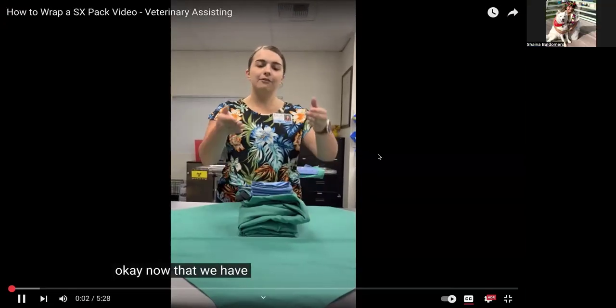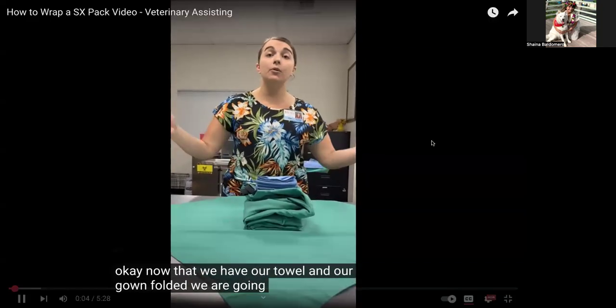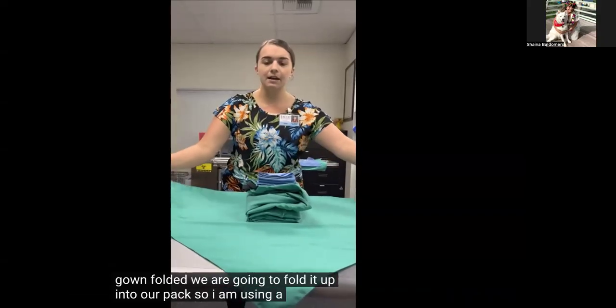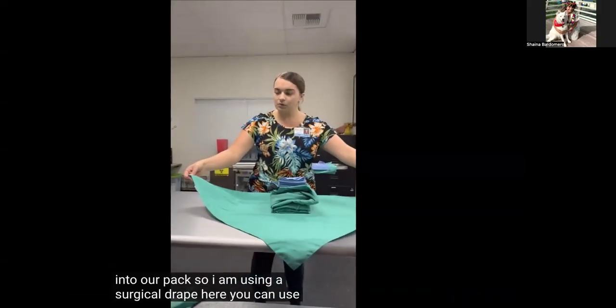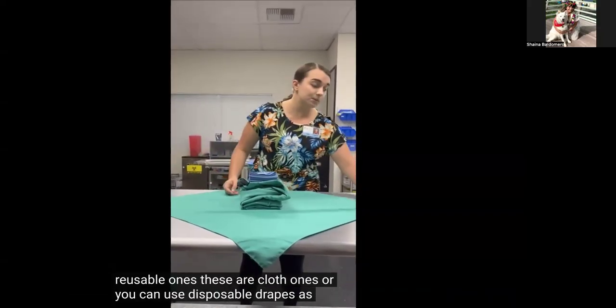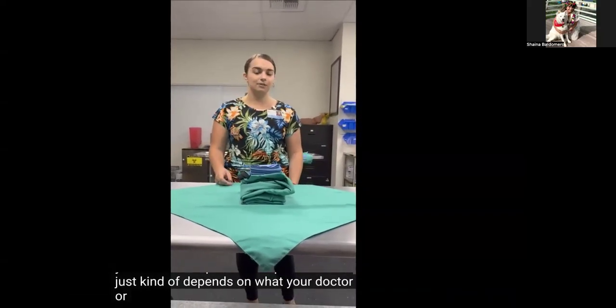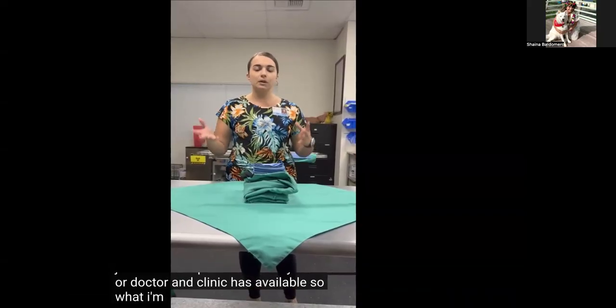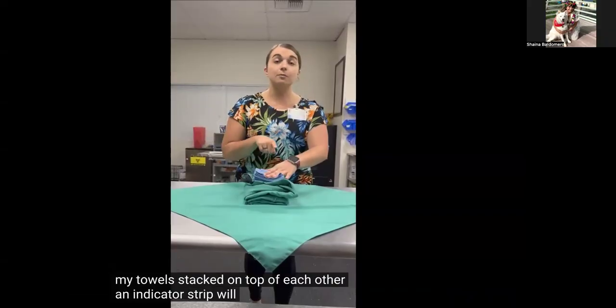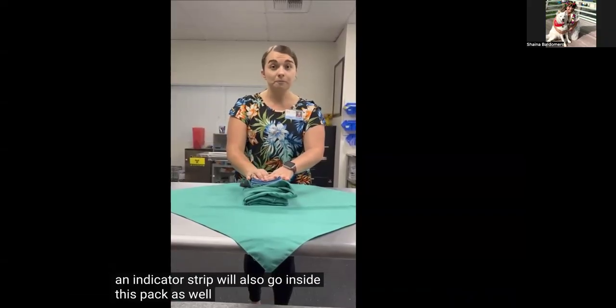Okay, now that we have our towel and our gown folded, we are going to fold it up into our pack. So I am using a surgical drape here. You can use these reusable ones, these are cloth ones, or you can use disposable drapes as well. It just kind of depends on what your doctor and clinic has available. So what I'm going to do, I have my gown and my towel stacked on top of each other. An indicator strip will also go inside this pack as well.